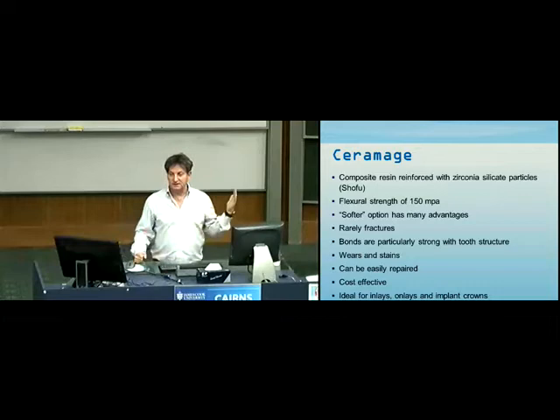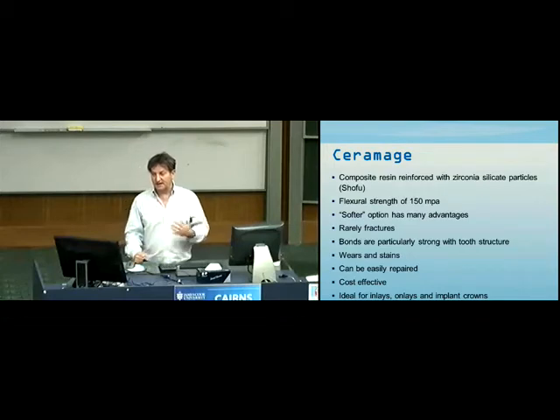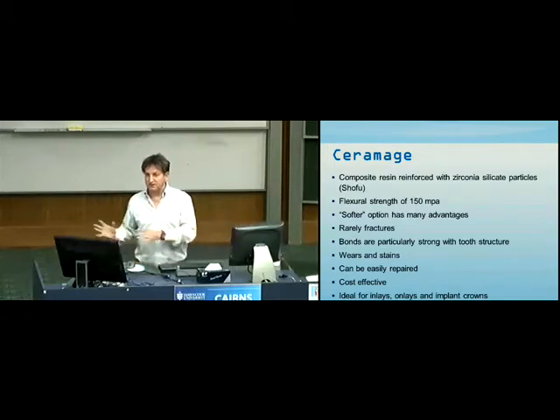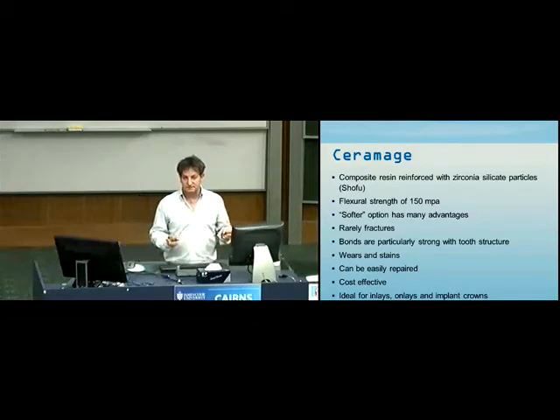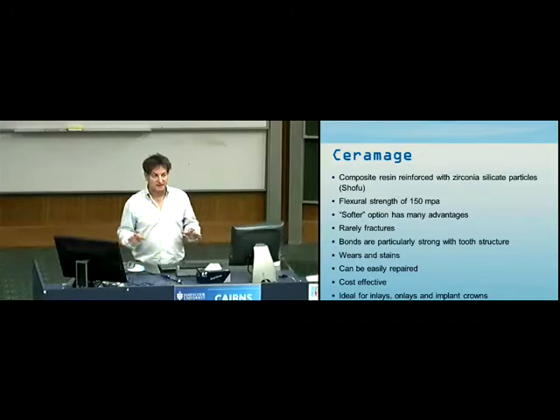Then we started doing some research in the early 80s, and we started to see there was a lot of drama with the hardness index, with wear and hardness in a lot of these materials. So there was a bit of a move away then. Ivoclar in particular wanted to go towards softer materials. Now this is very relevant to where we're heading today. I want you to really take this in.